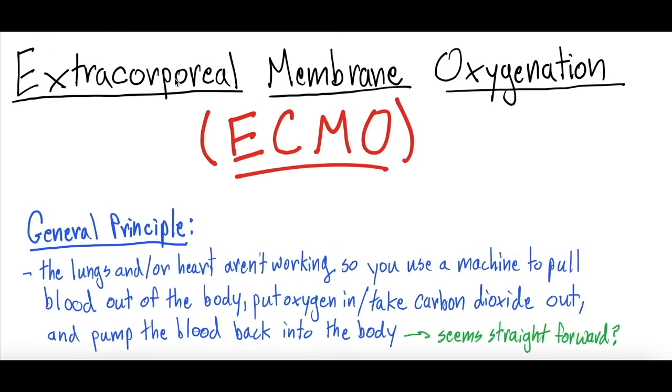Or extracorporeal membrane oxygenation. Now, depending on when you view this video, it was actually recorded during the COVID-19 pandemic, when, as a channel, we were coming out with a lot of COVID-19 related content. Now, ECMO is relevant to COVID-19 because severe end-stage acute respiratory distress syndrome from COVID-19, some of those patients have been placed on ECMO. But in today's video, we're going to be discussing ECMO in general. So it's going to be an introduction to the principles of ECMO.